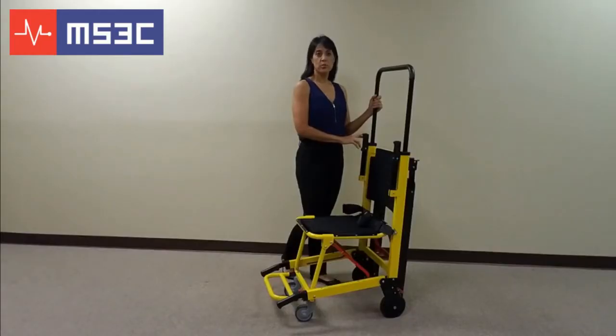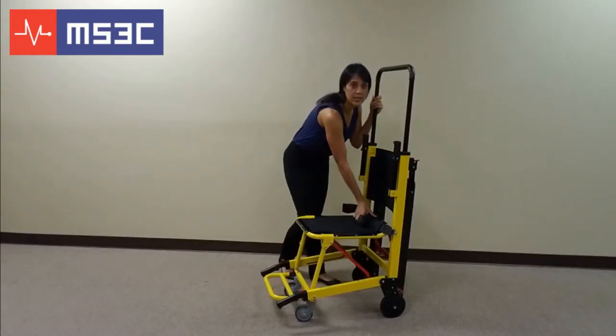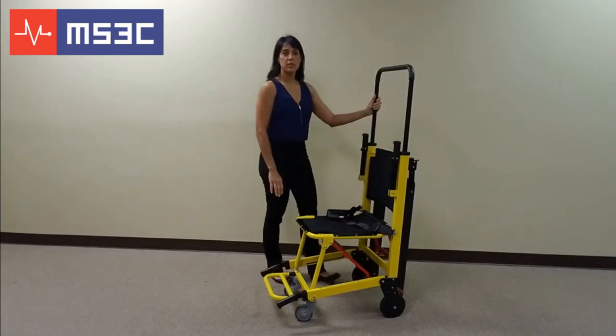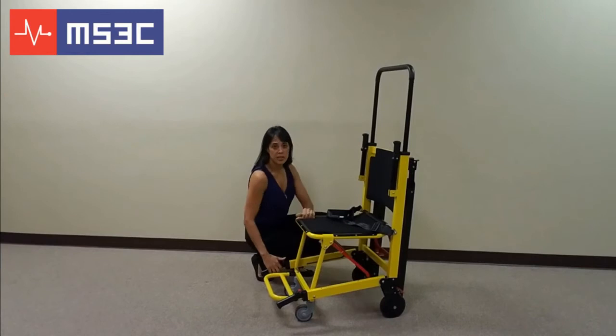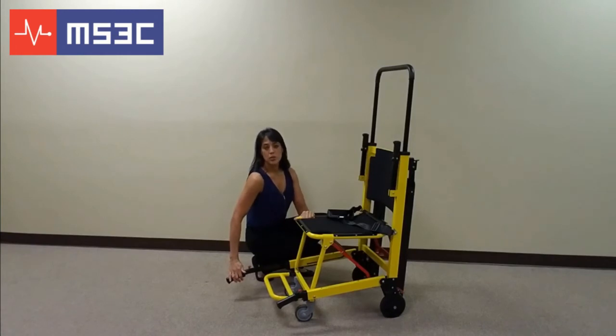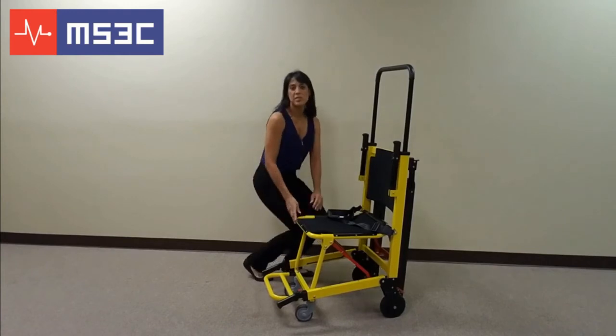The chair also comes standard with a hard seat and a lap belt to secure your passenger. There are also lower telescoping handles for a second operator when available. To use these, press the red button and pull out until it locks into position. To retract the handles, push the red button and slide the handle back to its closed position.